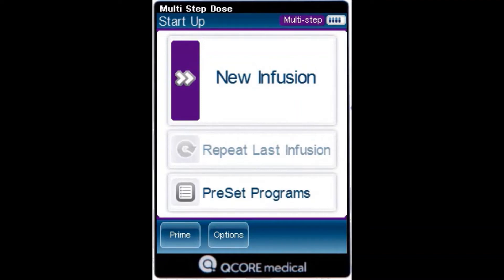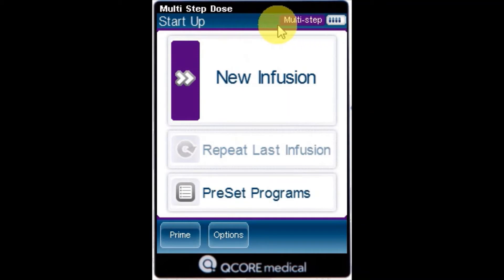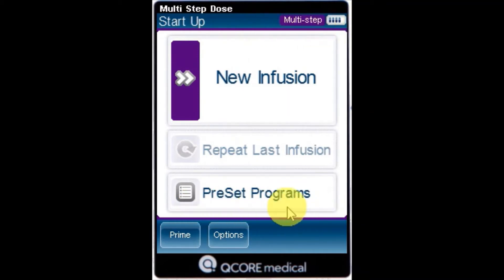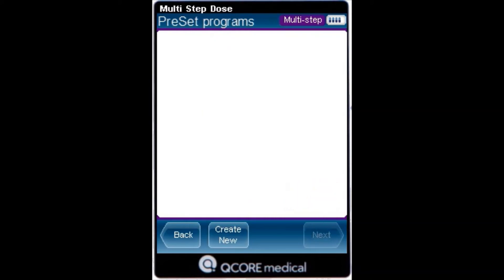To create a new preset program, from the indicator bar, verify the pump is in the desired delivery mode. From the startup screen, select Preset Programs. And from the toolbar, press Create New.